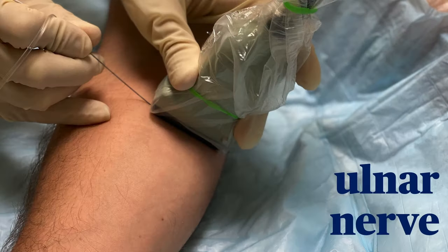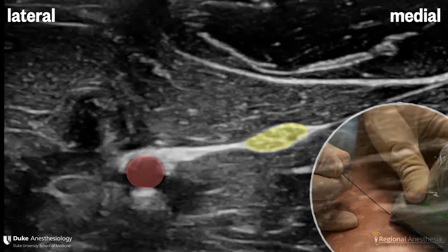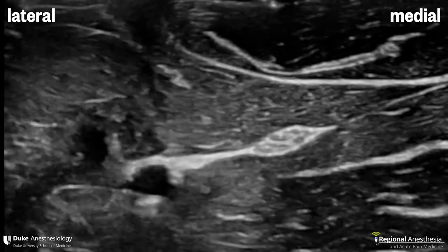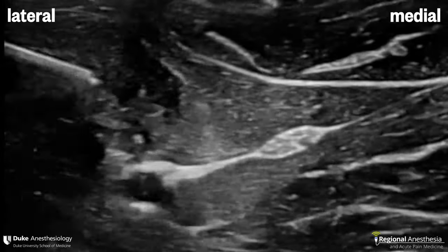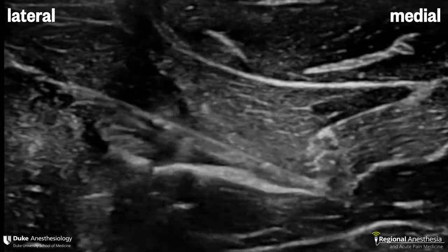The ulnar nerve is also easily visualized in the mid forearm. About halfway down the forearm, the ulnar nerve and artery start to separate from each other, and this type of image is what you want to see — with some slight separation so the artery is not in the line of fire. We use the same technique here, entering the fascial plane next to the nerve and injecting three to five mils of local anesthetic.